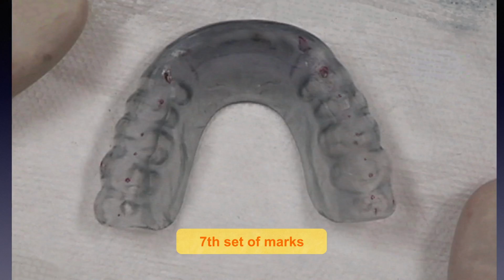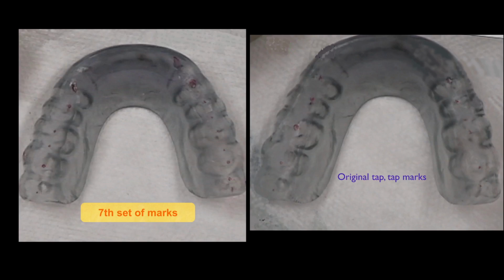As we learned from the previous video, jawbone geometry is not a simple matter. Here is a comparison between the original maximum intercuspation marks and the marks achieved in the new centric relation position after 6 adjustments of the acrylic. They look about the same, but the TMJs have gone from an at-risk configuration to a much safer configuration.